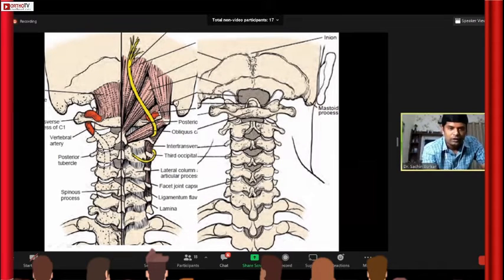And while doing exposure, which is the standard midline exposure, we have to respect the midline as in any posterior midline exposure in the entire spine, and use the intermuscular plane between the both sides muscles and do a subperiosteal dissection. And at the end of the construct, you should avoid damaging the facet capsule, as is true for all posterior spine exposures. So you avoid damaging the facet capsule above and below so that there is no degeneration there.